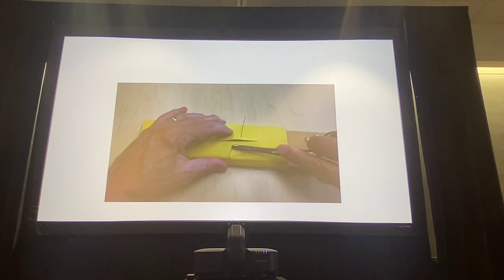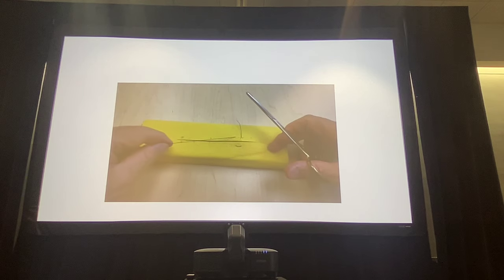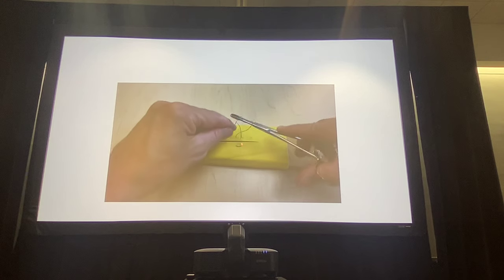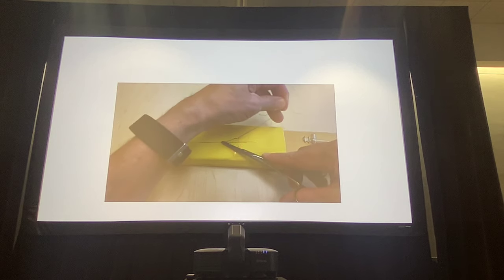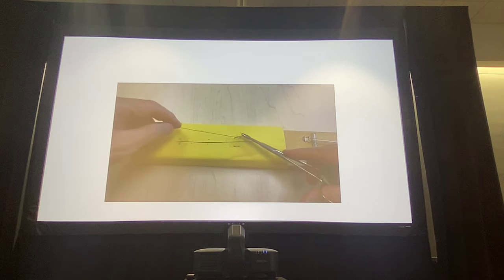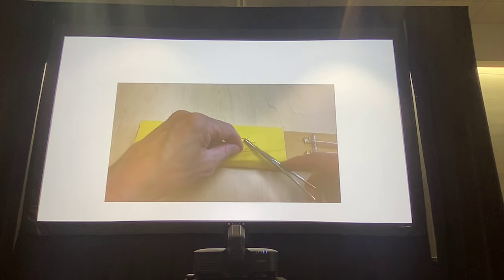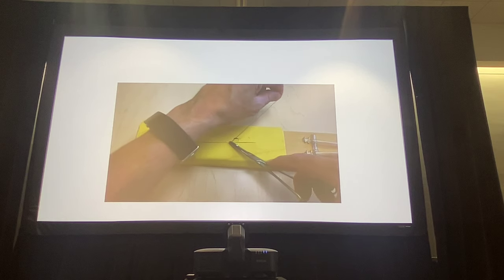But because of the eversion that you get, it could hurt the cosmetics a little bit. So hopefully when you're doing this, you're feeling the tissue on this side of your knot being pulled towards the knot. That's the idea. It's pulling that skin towards the knot. And then your surgeon's throw after that, and then the square knots.